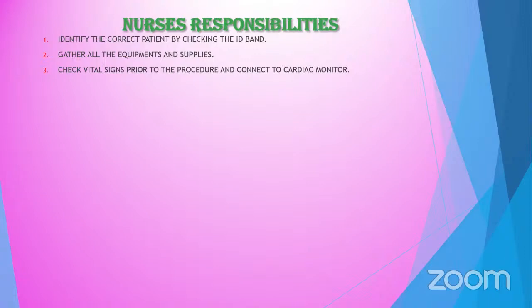Then check vital signs prior to the procedure and connect to the cardiac monitor. Always keep in mind that before starting the procedure, we should check vital signs and always connect the neonate to the cardiac monitor. And then we complete a safety pause prior to the procedure. In this pause we think if we prepared all the equipment needed, if we are ready, and if we did the sterile technique.